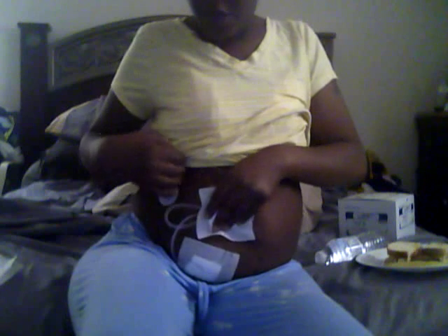you take your catheter and you place the red part against your skin, and then you wrap it around so the tip of your catheter lays on top of the red part, creating a loop. Now, you can do one or two things. You can take your patient line clamp, your catheter clamp, and you can also snug it in there, or you can leave the loop out. Well, this way, with it snugged in there, you just take that clamp and you snug it against the other two, and it leaves you a nice little loop on the outside.